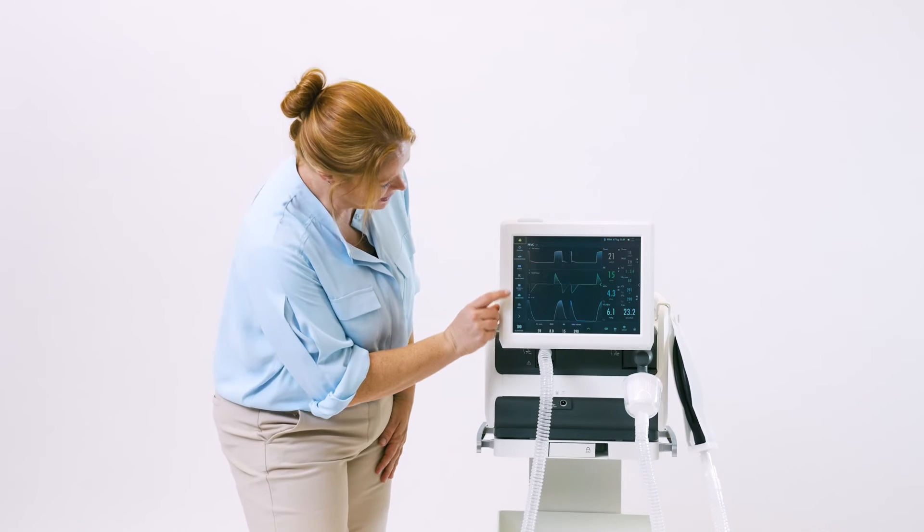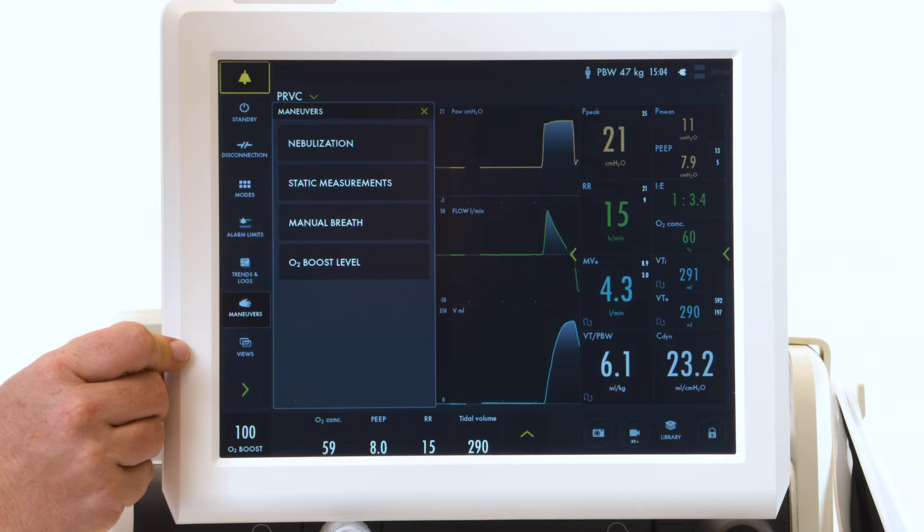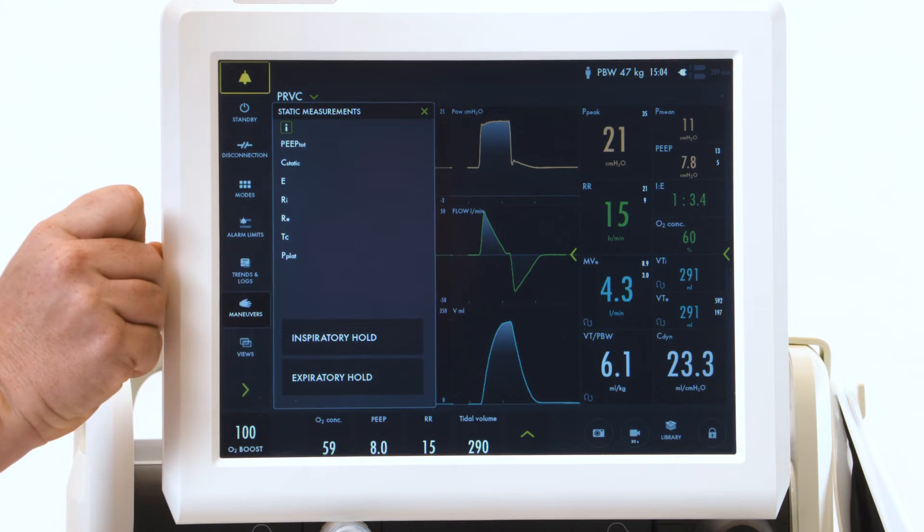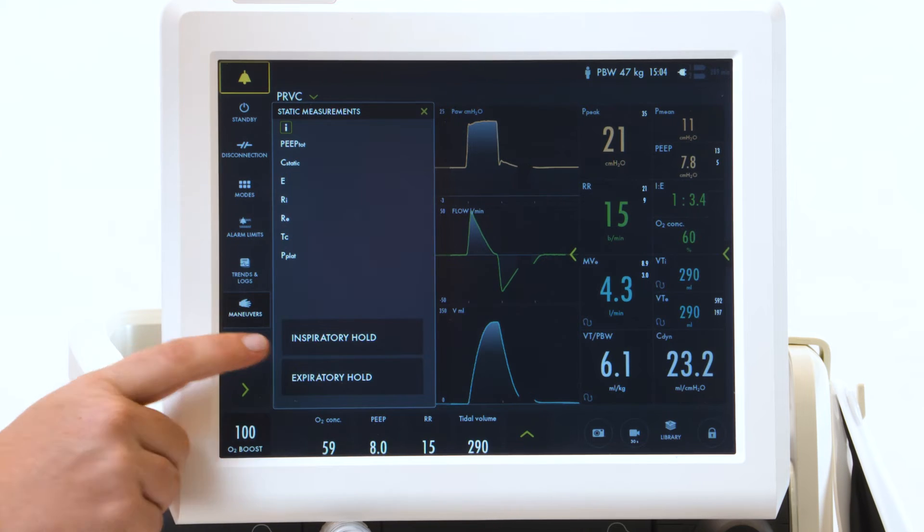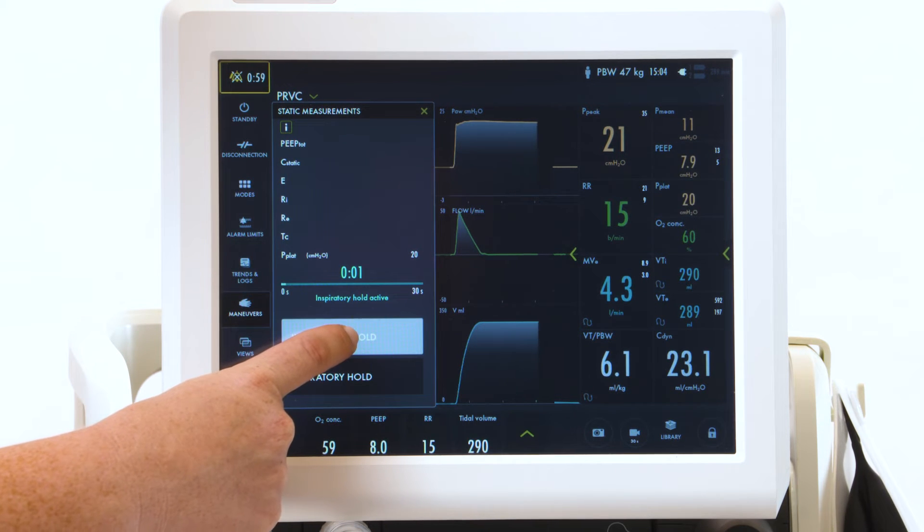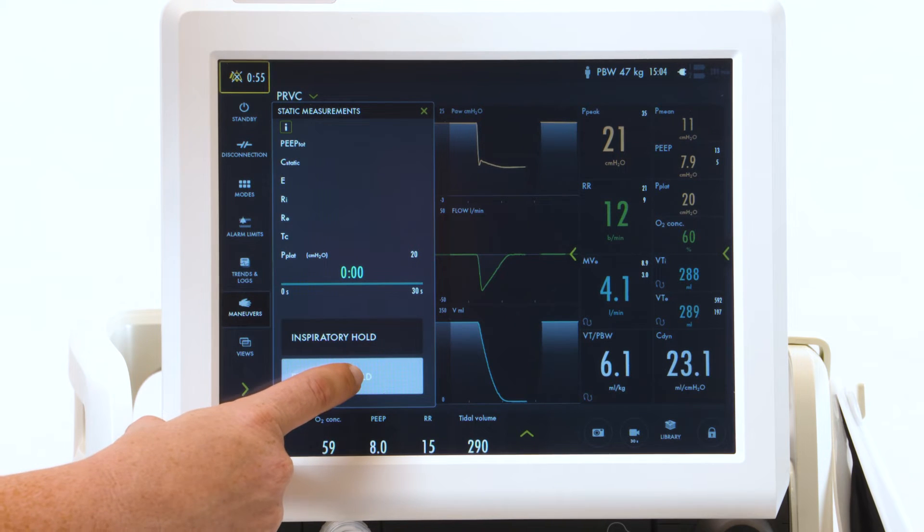Your inspiratory and expiratory hold are located underneath your maneuvers tab. Touch your maneuvers and select static measurements. This is where you can get measured values based on these holds. To activate an inspiratory hold, touch and hold until it beeps and says active for a second or two. Followed by an expiratory hold until it beeps and says active.